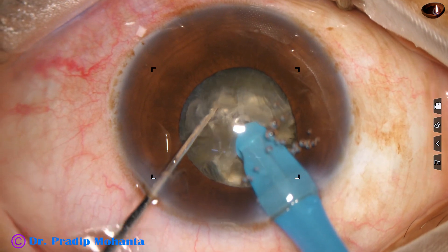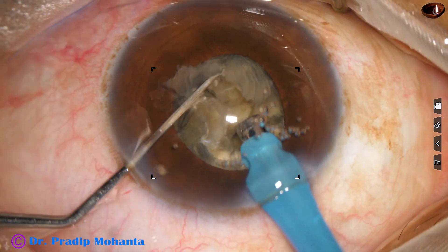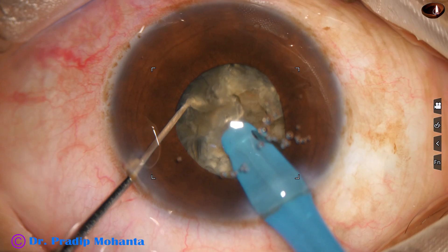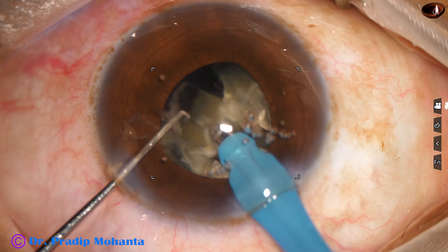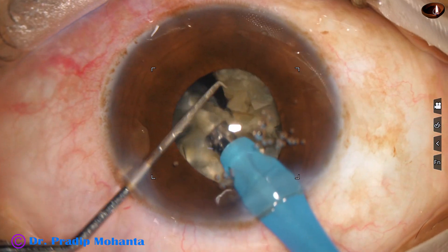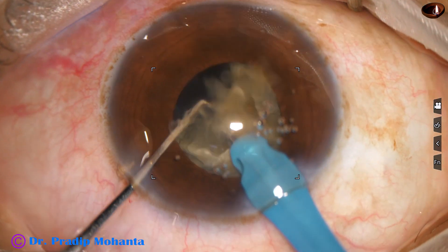Now I am dividing this hemi-nucleus into three pieces — this is one piece. I divide this piece into two, and thus I get three pieces. With high ultrasonic energy, about 80% in continuous mode, I use continuous mode intermittently.